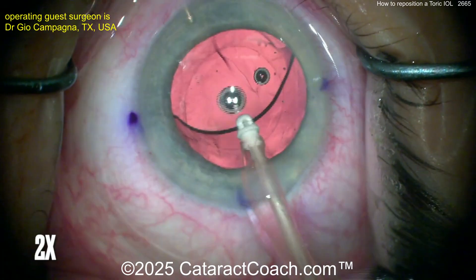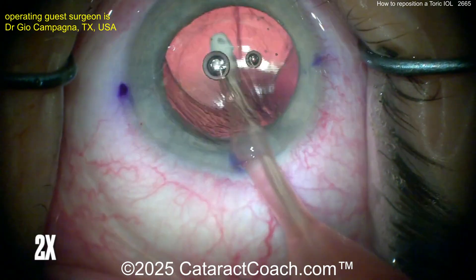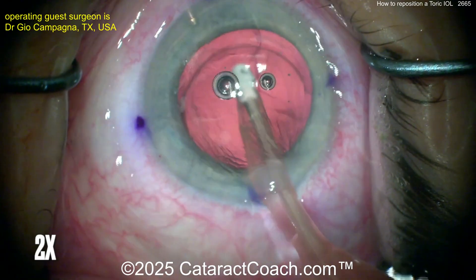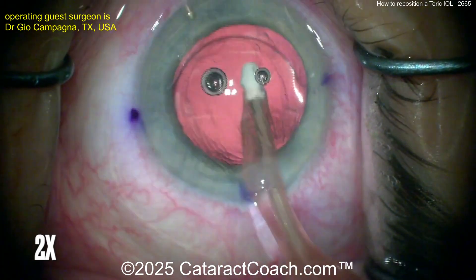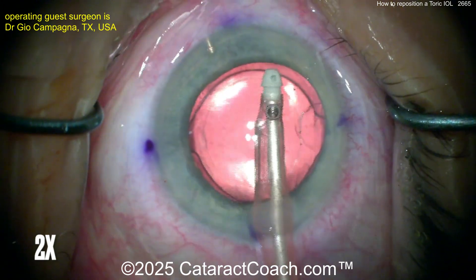Using the I/A probe, make sure you get out all the viscoelastic. Definitely always go behind the optic and remove that viscoelastic. Because we used a dispersive agent here, it's going to take a little more effort to get it all out — you dissected the bag with a dispersive. Normally in a virgin cataract surgery, using a cohesive viscoelastic to fill the capsule bag, it's a lot easier to remove. So take your time and really remove it.